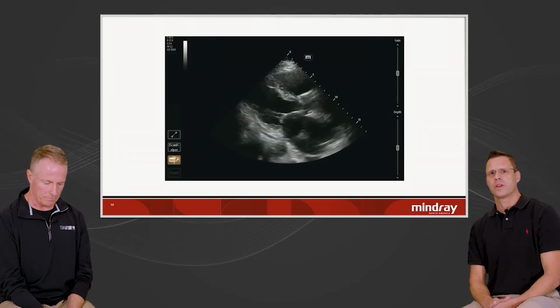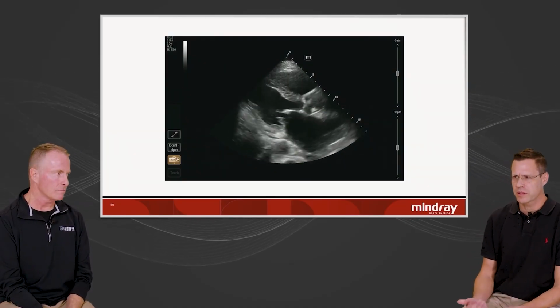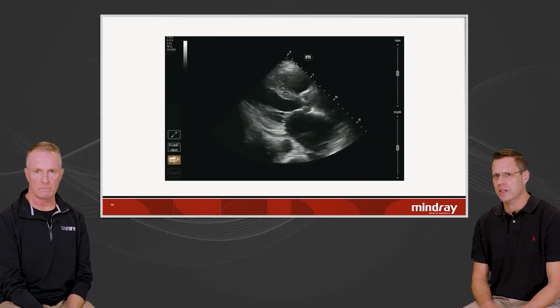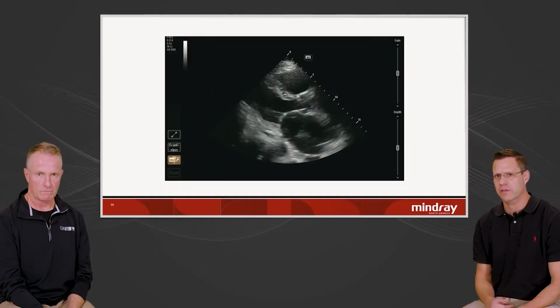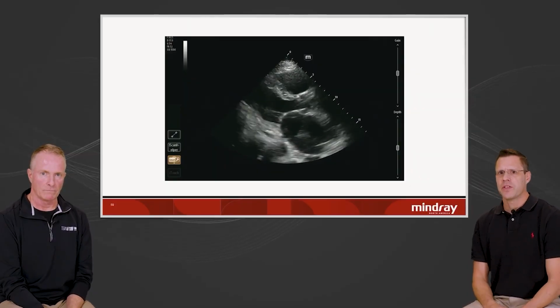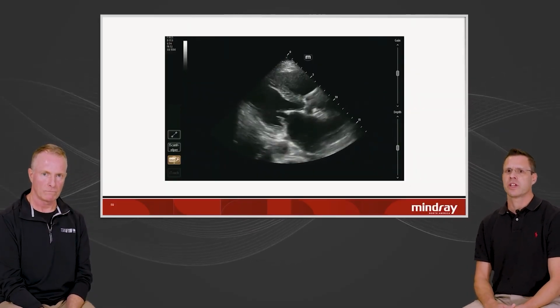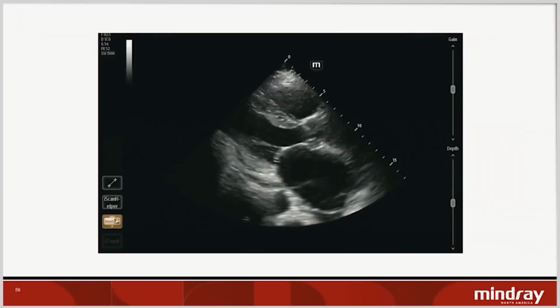I think when you're starting to do echocardiography, and we teach this after you're able to obtain the heart image from multiple windows, the next thing is just to really have a systematic approach, not just to your evaluation, but also your evaluation of cardiac images. We believe that in about 70% of people, you can get a good parasternal long axis view of the heart. And this view gives you more information in 1 minute than you could get through auscultation for the rest of your life. You get a great view of the pericardium.